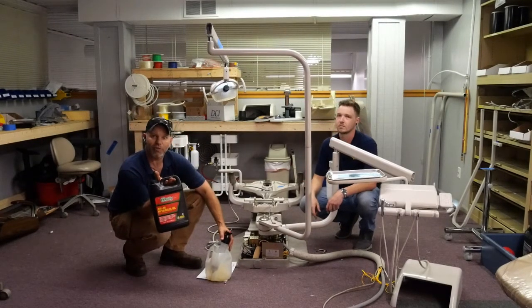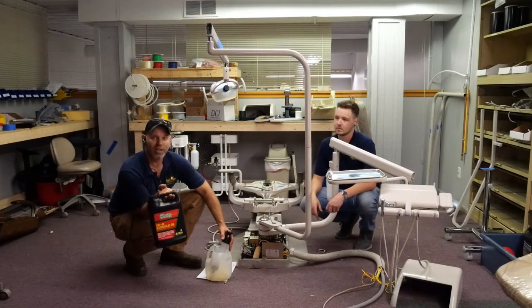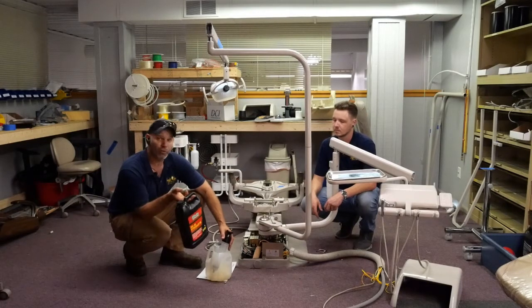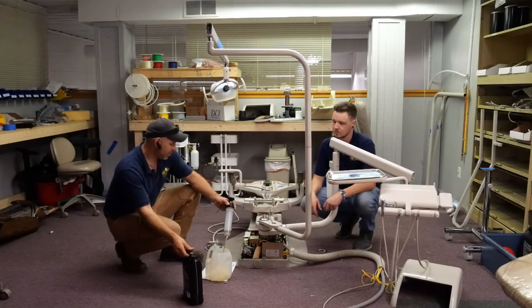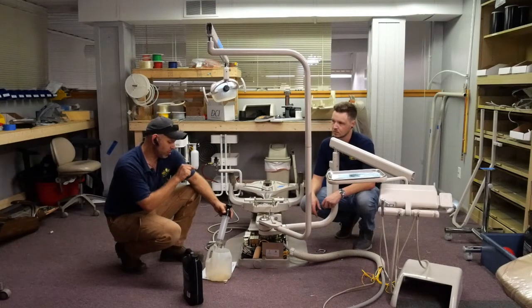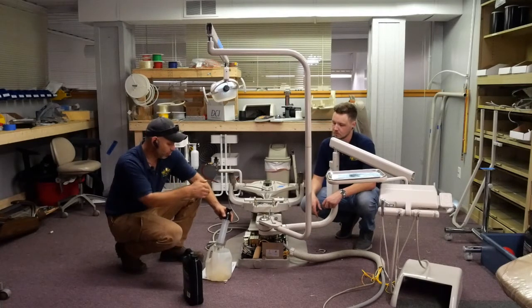This is AW46 hydraulic fluid, and you can buy this from your local auto parts store. This container right here was about $20, and this fluid is actually the fluid that's spec'd for the Adec dental chairs, like the 1040 that we have here. And this is the way that you would remove old oil from your chair if you were to do an oil change, where you could pull out the old oil and put in new oil.